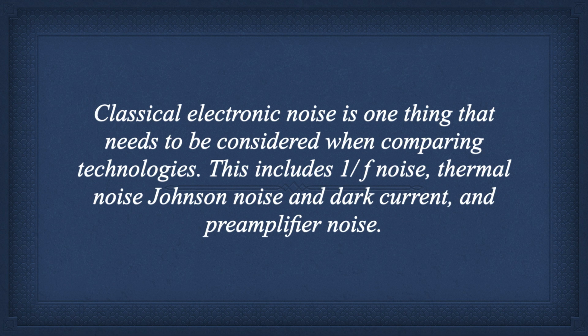Now, we have a problem with noise in SS-OCT and spectral radar that's less of a problem in TD-OCT. If we take low frequency noises that are inherent to the electronics, in TD-OCT, we have a way of getting around that that's not easy to do with the spectral techniques.